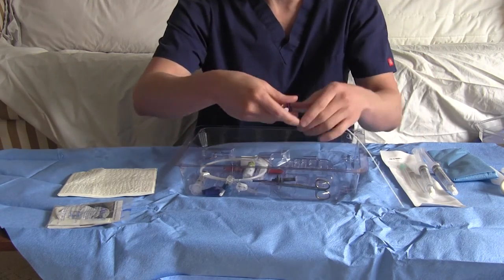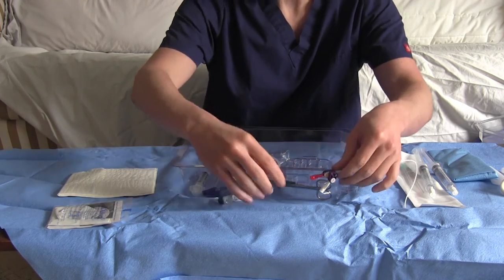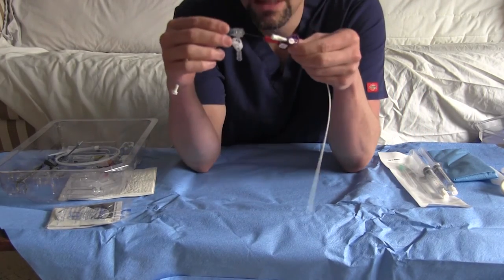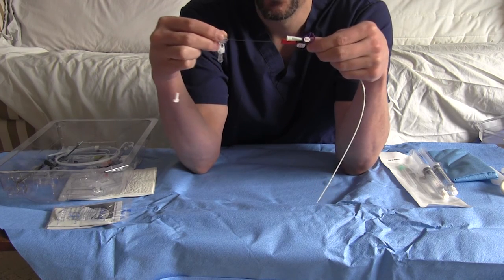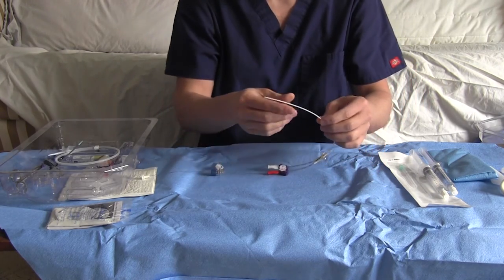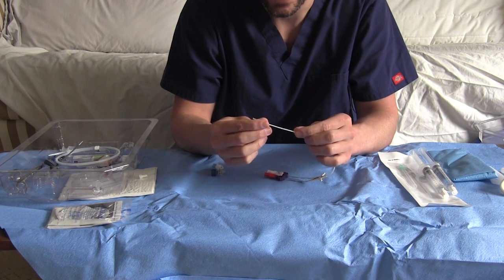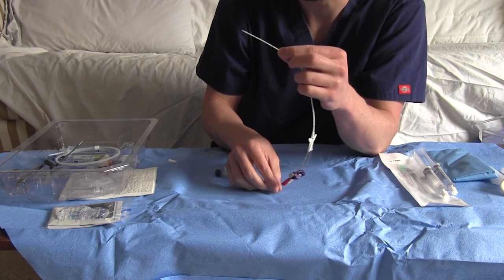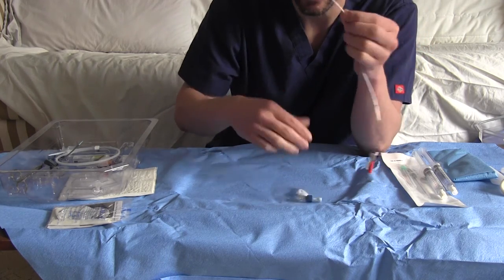You've already taken your measurements for how deep you actually want to go. So here's the deal. What we're going to do is inside this is this stiffening wire, and that makes it easier to pass, but you don't want to cut that stiffening wire. So what you're going to do is look at the centimeter marks. Let's say you measured at 17 as the length of the midline you actually want. I take this wire out entirely. I don't know if the camera will pick that up, but the wire's now out of this midline.